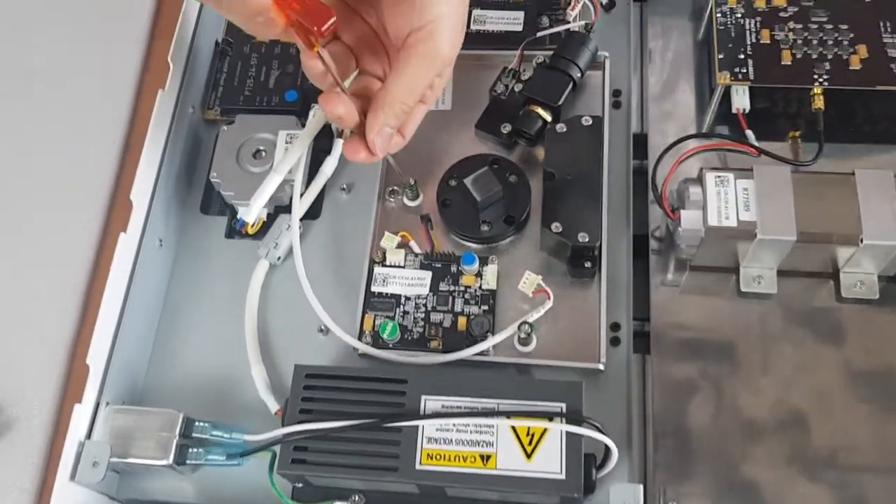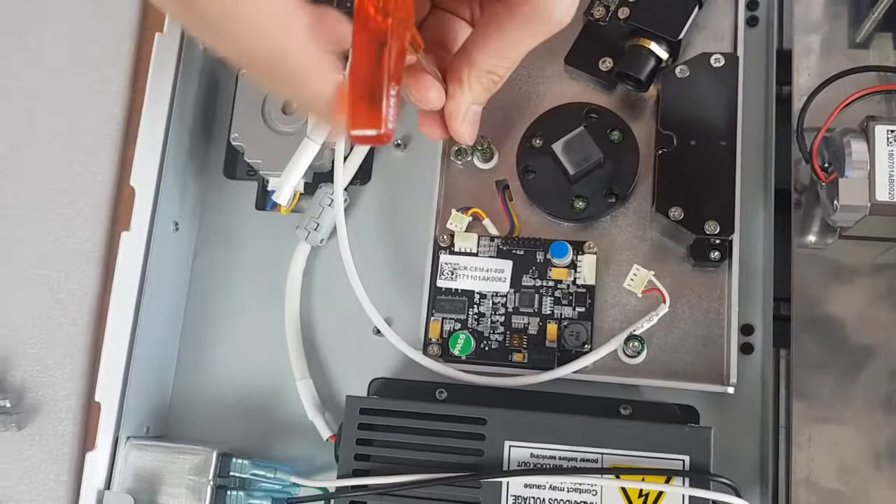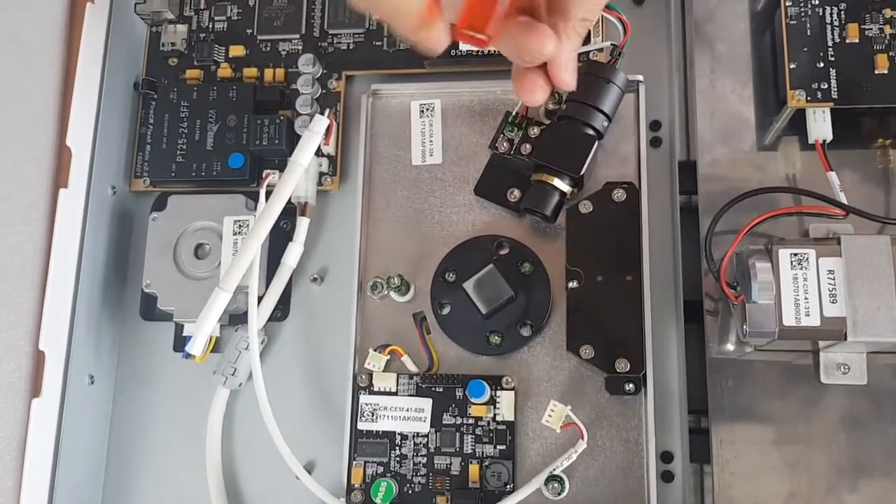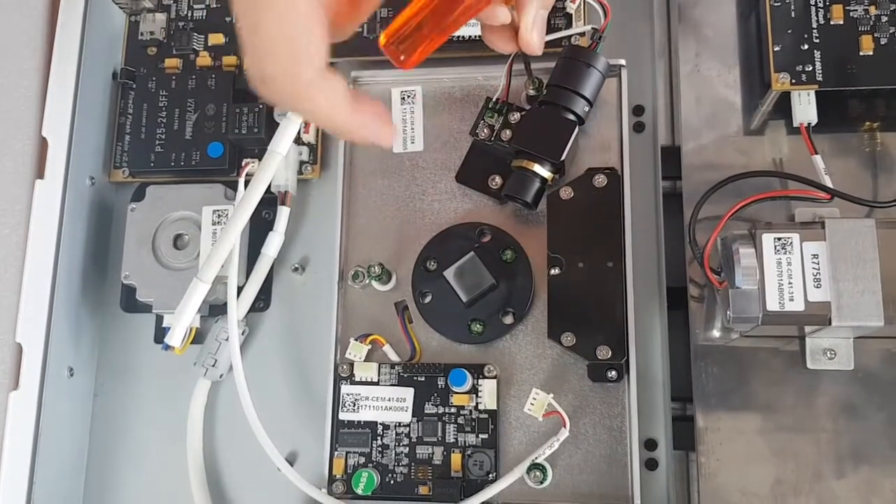You don't necessarily have to take these out. Just loosen them up until the point where you can lift the optic plate up.